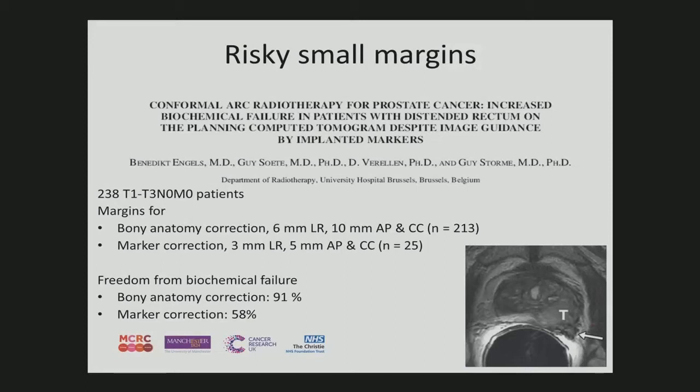And if you look at a prostate cancer MR scan, very often you can see that there's a dominant lesion. This is the prostate. The dominant lesion, and the tumor grows out of it. Things grow out of it, and they grow out of the prostate into the surrounding tissue, typically by 1 millimeter or 4. If you have a 1 centimeter margin around because of the uncertainties, that's negligible. But if you shrink those margins to 3 millimeters, then all of a sudden you're going to miss a lot of patients. So it basically means that from physical accuracy, we have to start thinking about the biology.